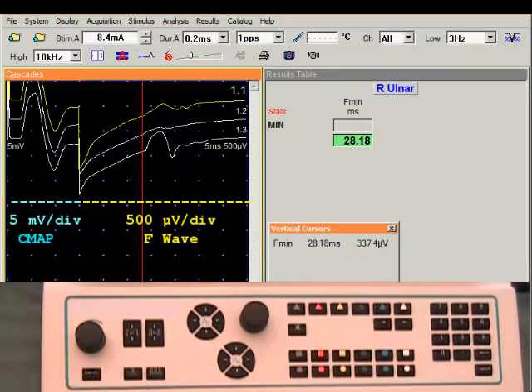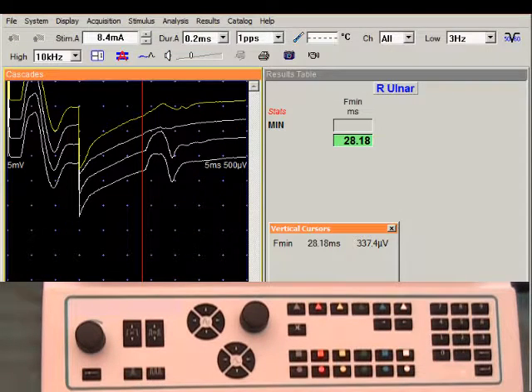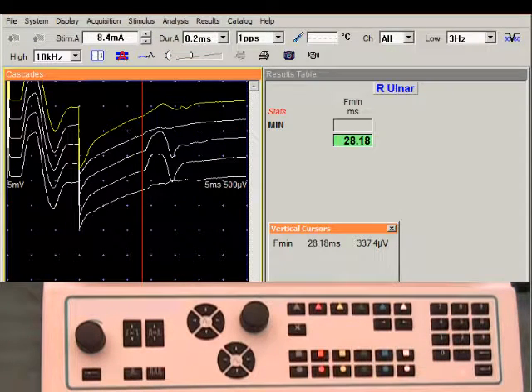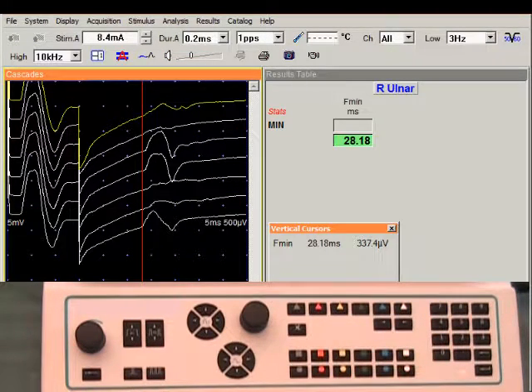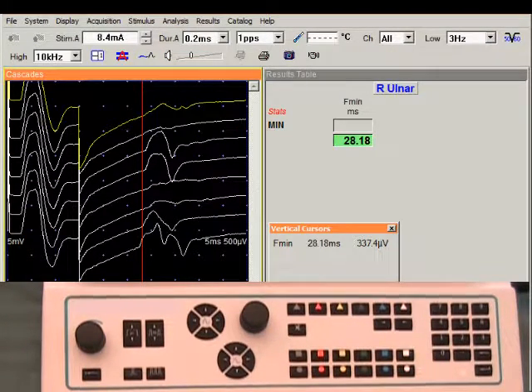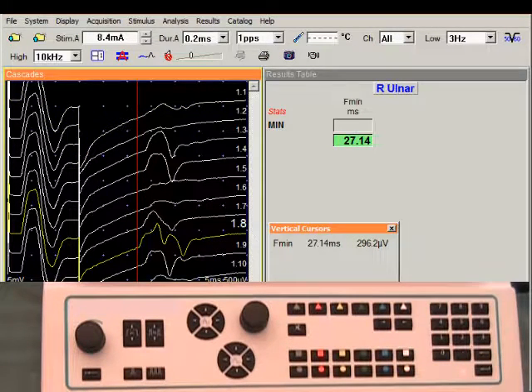I'm going to select the single stimulus two or three times, and now I'm going to switch to the recurrent stimulus to record the rest of my F-Waves. The stimulator will automatically stop after 10 selections.